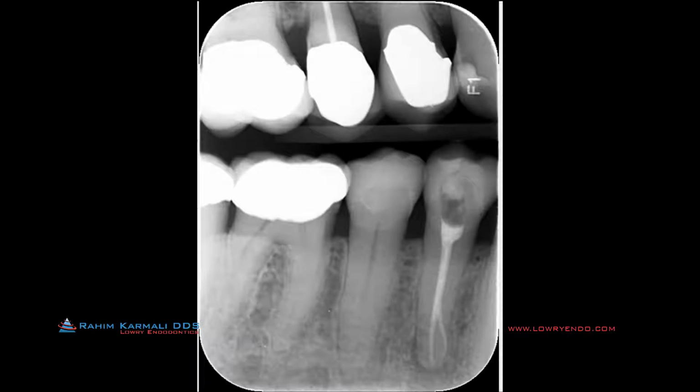So this patient presented to me in pain isolated to number 28, and testing verified 28 was the source. Radiographically, at least two-dimensionally, you can make out a hint of a potential lucency around the apex of this tooth, meaning a potential abscess. There are three things that concern me about this case.